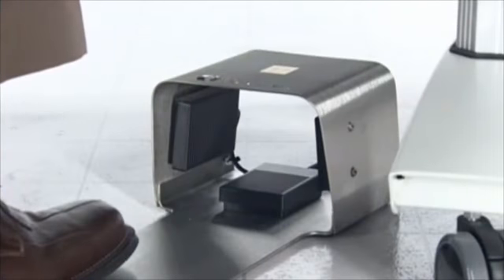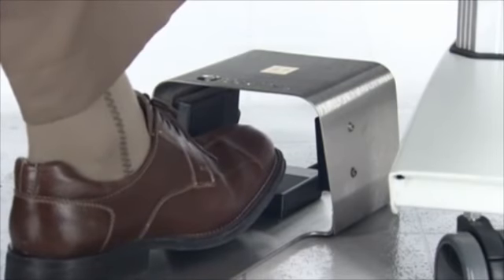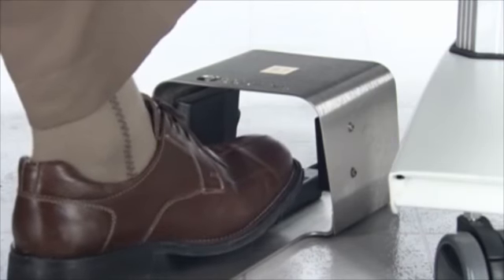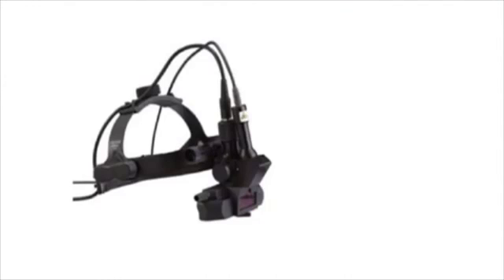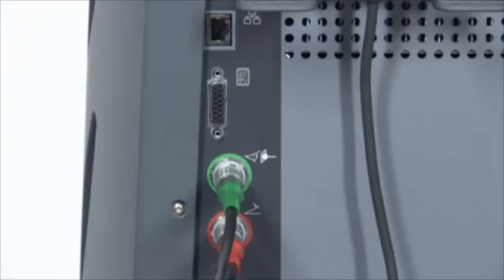If you are using the power ease foot switch, you can adjust the laser power by pressing the switches on the inside left, decreasing power, and right, increasing power, of the foot switch housing. A variety of fiber optic delivery devices with associated eye safety filters are available for use with Lumenis Vision 1 ophthalmic systems. Refer to the appropriate delivery device operator manuals for specific operating instructions.